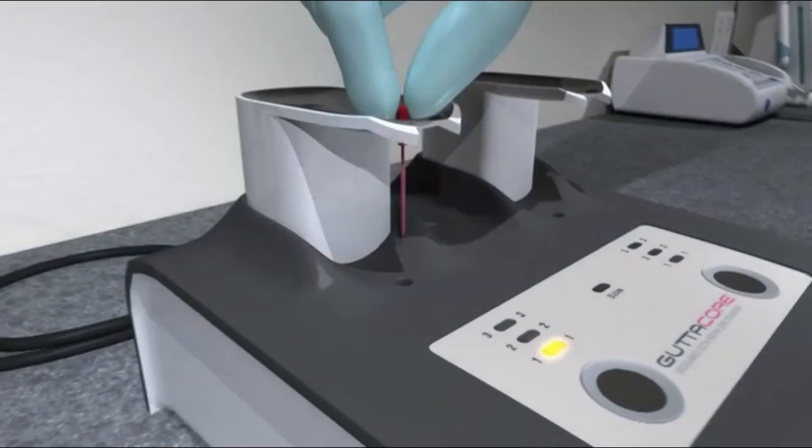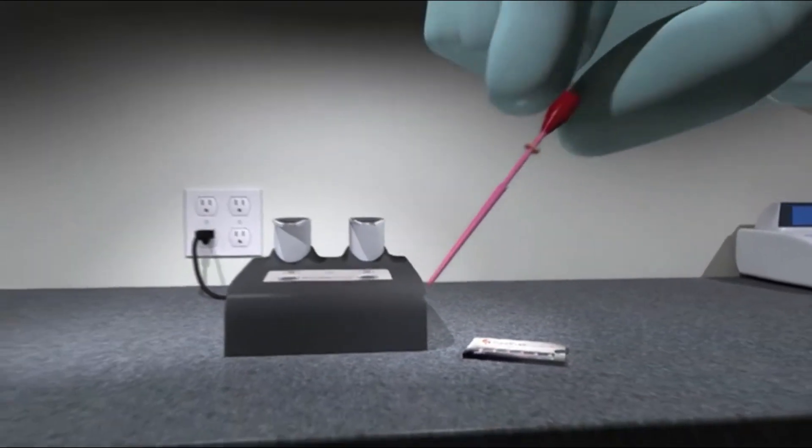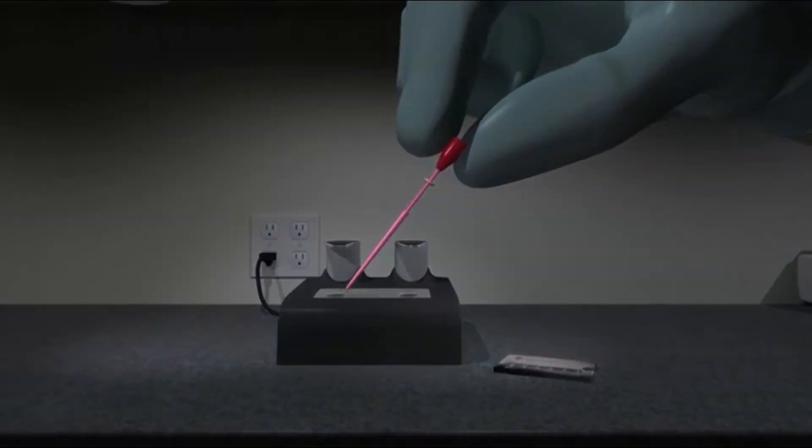GuttaCore Obturators are coated with the same flowable alpha-phase Gutta-percha that's provided predictable fills for more than 20 years. But GuttaCore is changing obturation from the inside out.